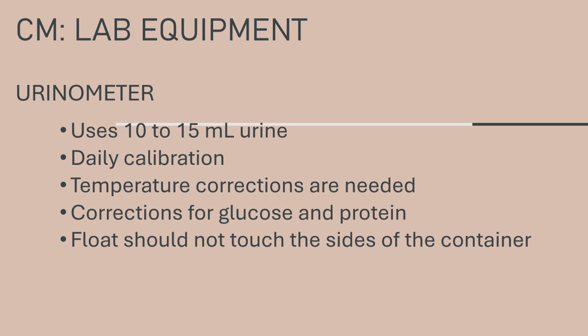0.004. Also please note that the float should not touch the sides of the container, because if it touches the sides, it will give you a not so reliable result. These are the disadvantages of the urinometer: large volume, daily calibration, temperature corrections, and corrections for glucose and protein.